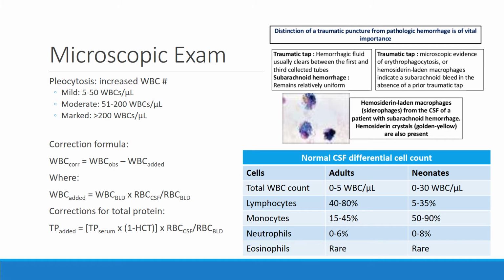Now, the traditional method for doing a microscopic exam for a cell count would include the hemocytometer, which I know you just enjoyed using so much in hematology. When I was coming up, that's what we used because automated systems weren't all that great working with CSFs. They've improved the automated systems to the point where we actually do use instrumentation to get cell counts on most of our CSFs.